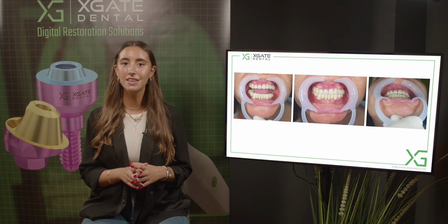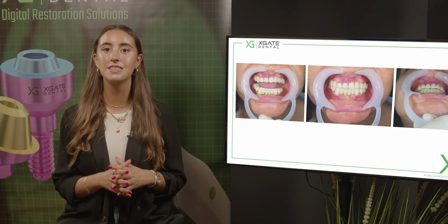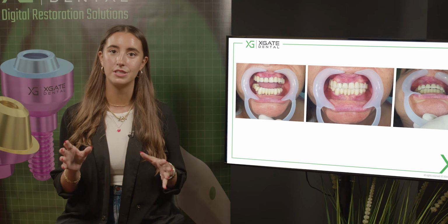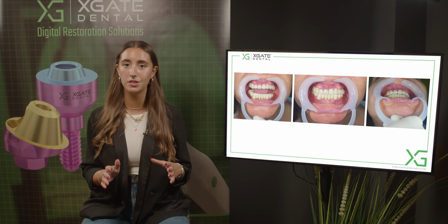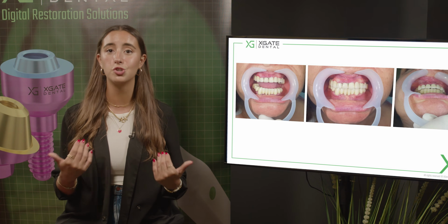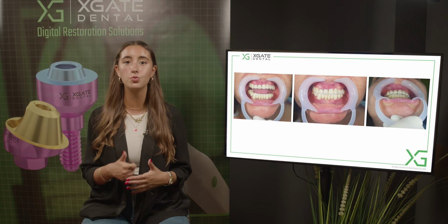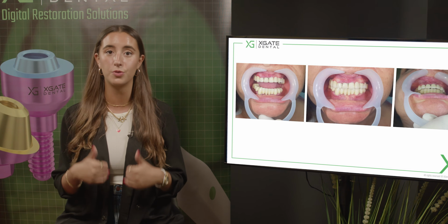You can see that the height of the canines is different and the height of the central incisors, and you can see the second incisors are different in sizes. It's a PFM bridge. You can see that the central line is not perfectly aligned. You have a lot of small problems, but the main reasons why we want to change the bridge and extract the teeth and do implants is not the aesthetics. It's the caries and the teeth under those bridges.